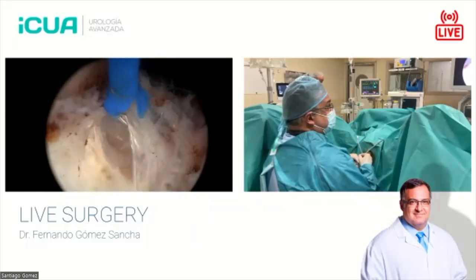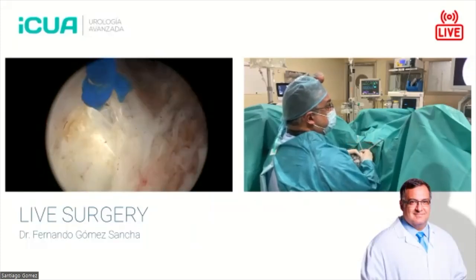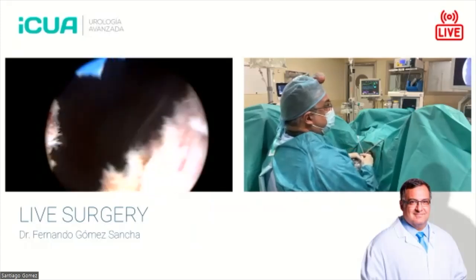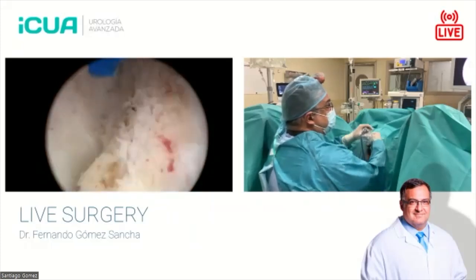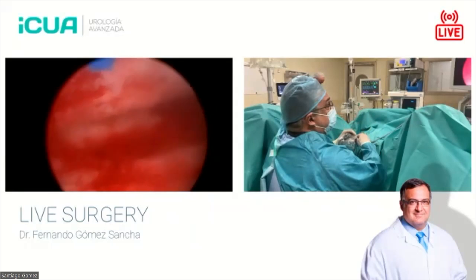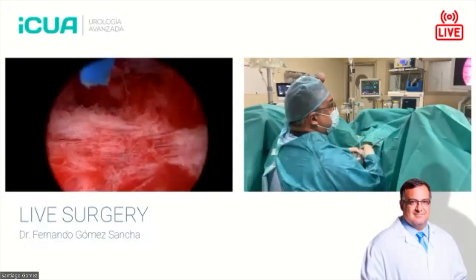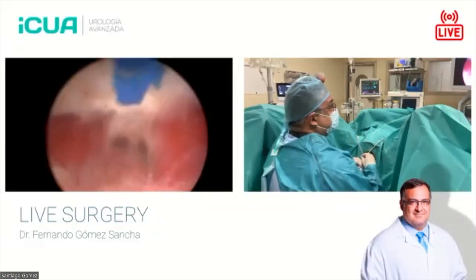No-touch, of course, when you fire the laser from a distance and you let the laser do its effect, it's very nice. But sometimes when you do a lot of cases and you have experience, you find certain fibrous areas where you want to move faster, and then you do a little bit of contact. It's not the end of the world, you know what I mean? This is already dissected.